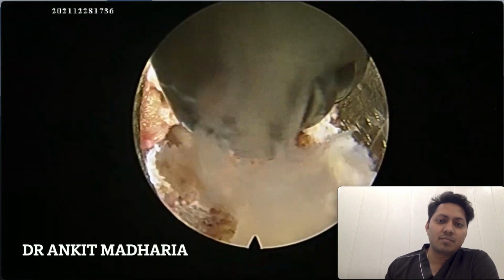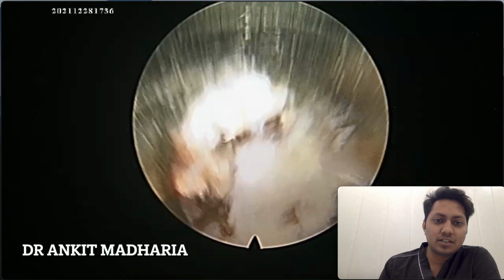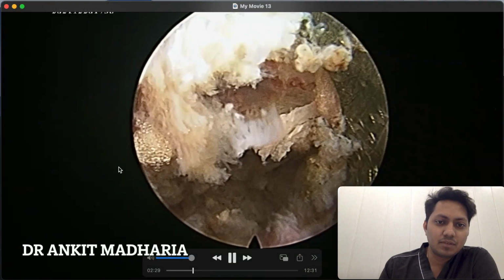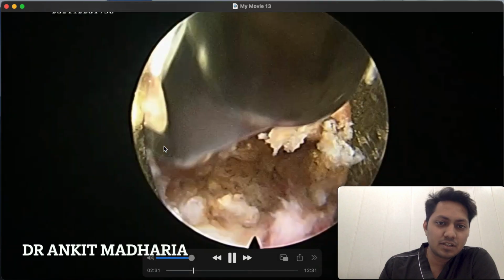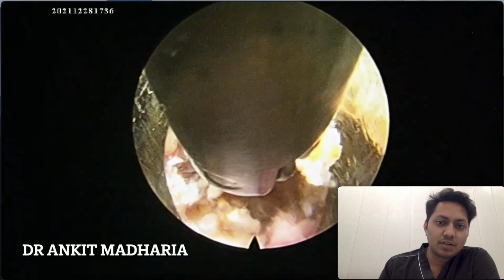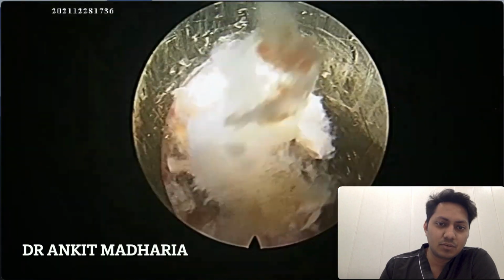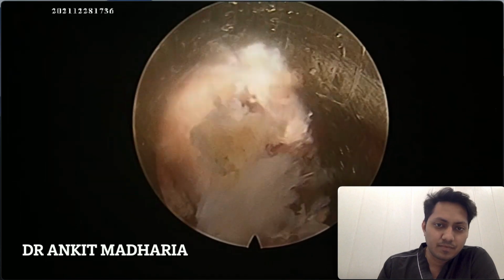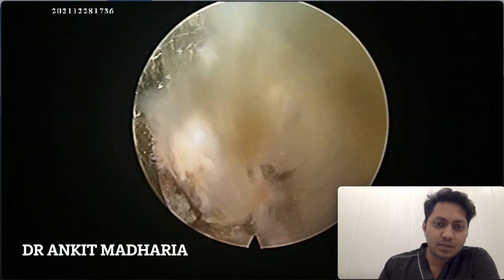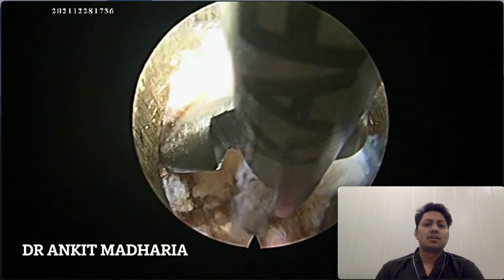Now this is a right biting articulated curette, and I am trying to reach the tip of SAP, and this is where the tip of SAP is there, and I am trying to release the ligamentum flavum from there. So ligamentum flavum is attached at the tip of SAP, so it is very easy to remove it once we start from here. I am removing those ligamentum flavum, and I am basically undercutting the facet joints right here.